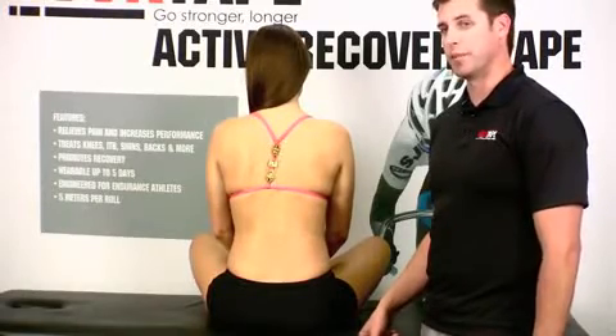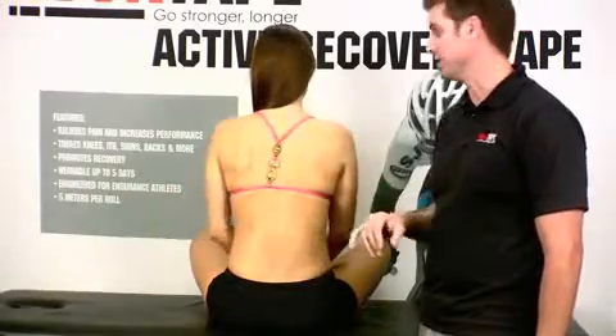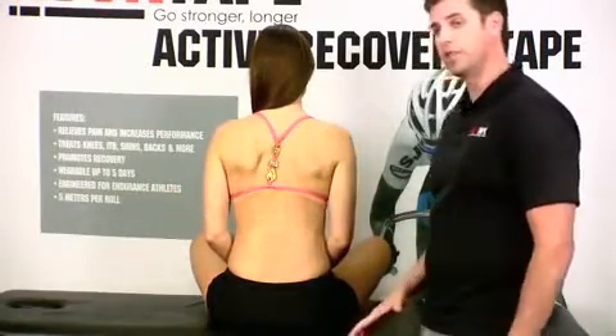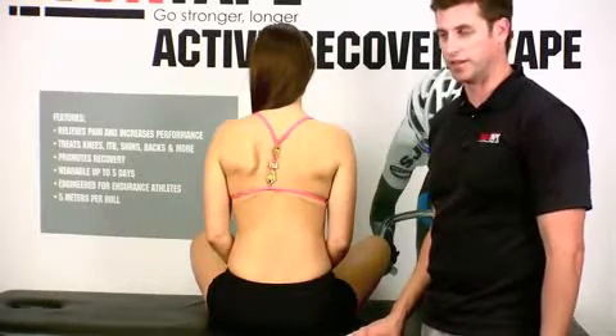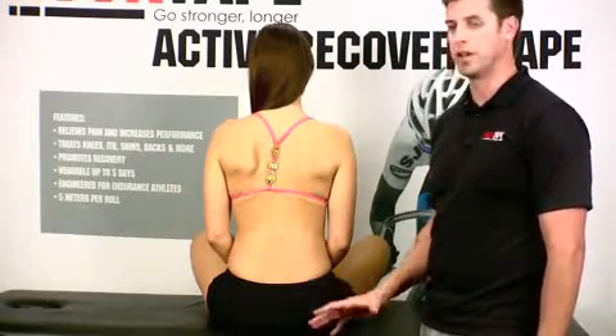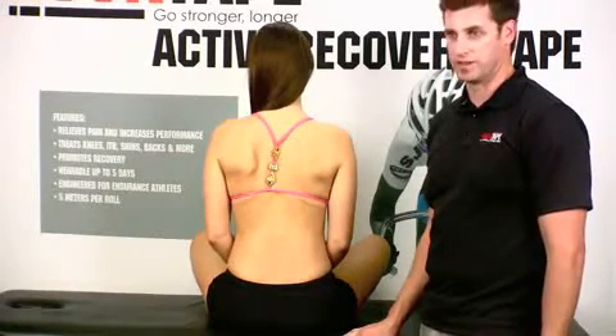A lot of times when these patients come in, they're going to complain about pain around T1, C7, C6, maybe even the C5 region. There's a three-step process we're going to go through today. First is to stretch the area — again, to your patient's tolerance. Second is to stabilize the area. Third is to decompress the area.